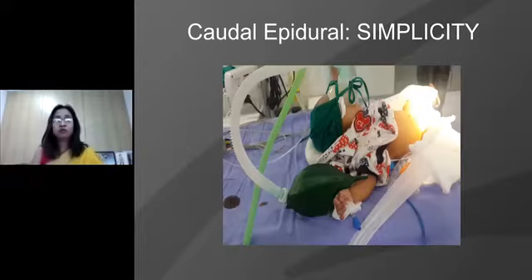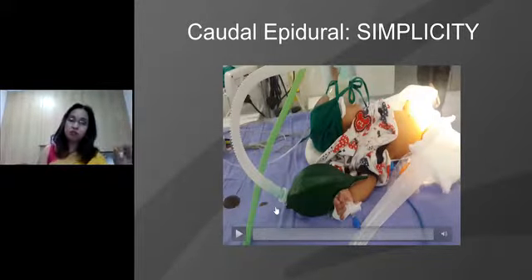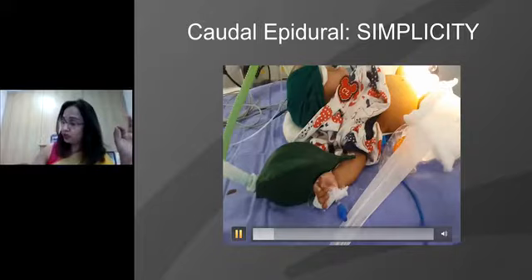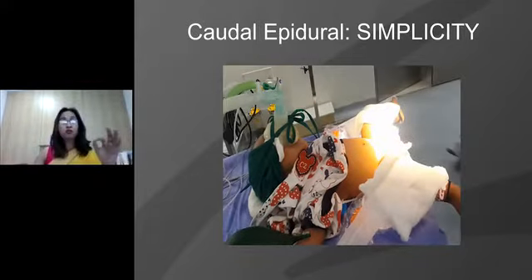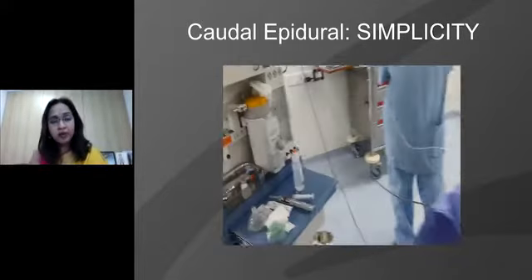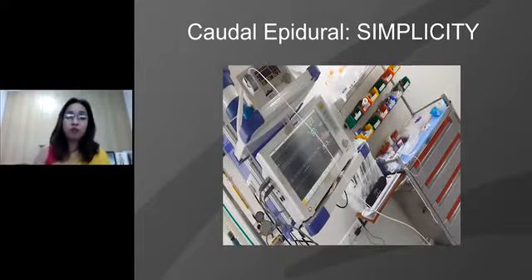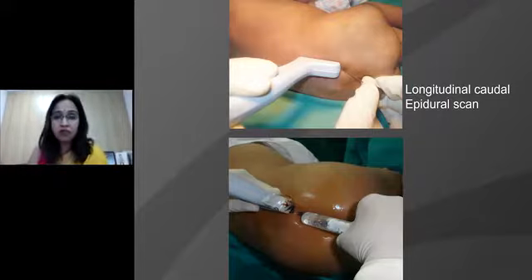So coming to the central neuroaxis, I think the best possible aspect that central neuroaxis has indeed imparted to pediatric anesthesia as such is the simplicity that it has. If a little baby has to be anesthetized with very simple technique, say for a cystoscopy or a hernia or any for that matter, non-cavity invading surgery, any superficial surgery, we can do it with simple mask and a well-placed caudal block. And the baby kind of keeps on breathing on her own, and the surgery happens without much change in the physiological milieu. Let's understand the scans here with the caudal block, so that we're very clear about the markers that it actually offers to us.